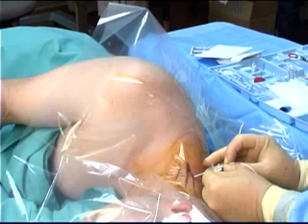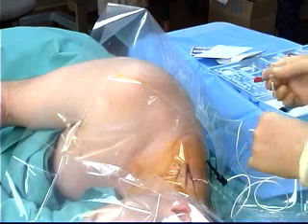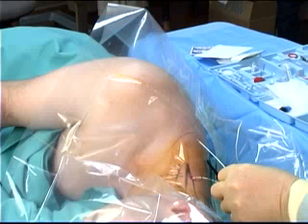Advance the catheter approximately 3 to 5 centimeters beyond the needle tip, but not further than 5 centimeters. Remove the needle without disturbing the catheter and remove the inner stylet of the catheter. The catheter position can now again be confirmed by attaching the nerve stimulator to the catheter. The motor response should be unchanged.